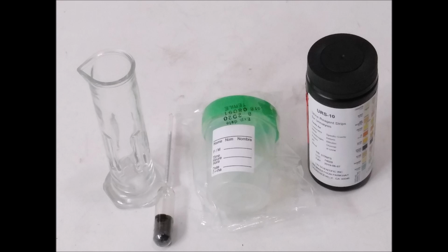It is well worth noting that a specific gravity test should not be used as a standalone test for diagnosis. Later in the exercise, we'll be using the URS test strip, which will provide us more insight into the functioning of the patient's kidneys.